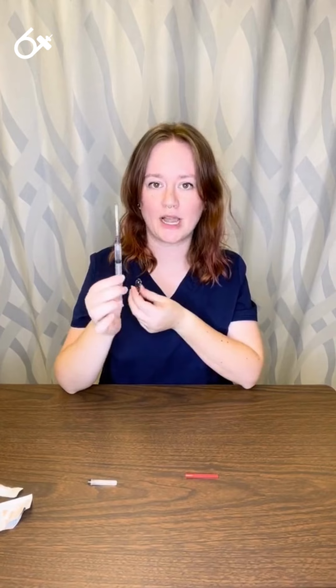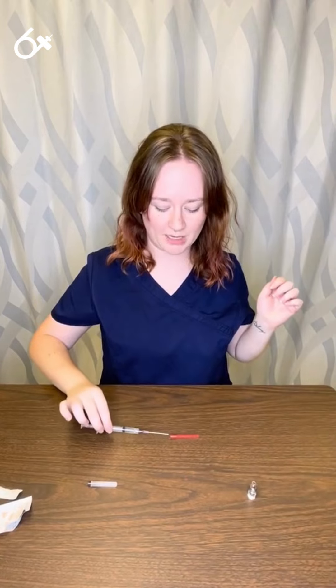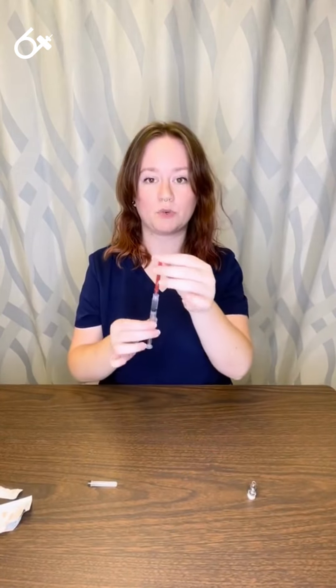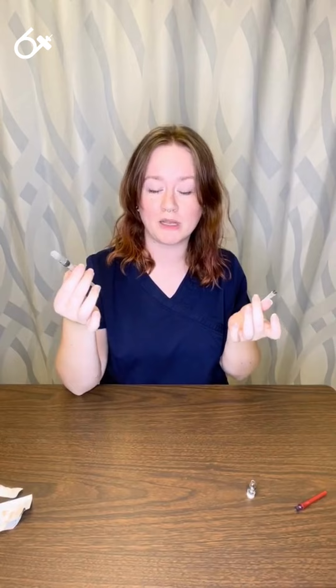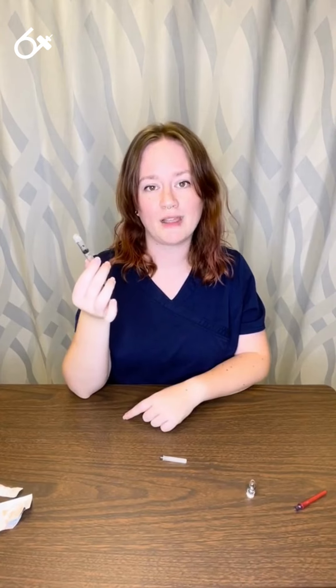After I withdraw medication from my ampule with my filter needle, I then need to get rid of that filter needle. I can use that scoop method to recap my needle, remove the filter needle, and then at that point I can put a different needle on if I'm doing an intramuscular or sub-Q injection, or I can use this with a Luer Lock system to insert it into an IV line.